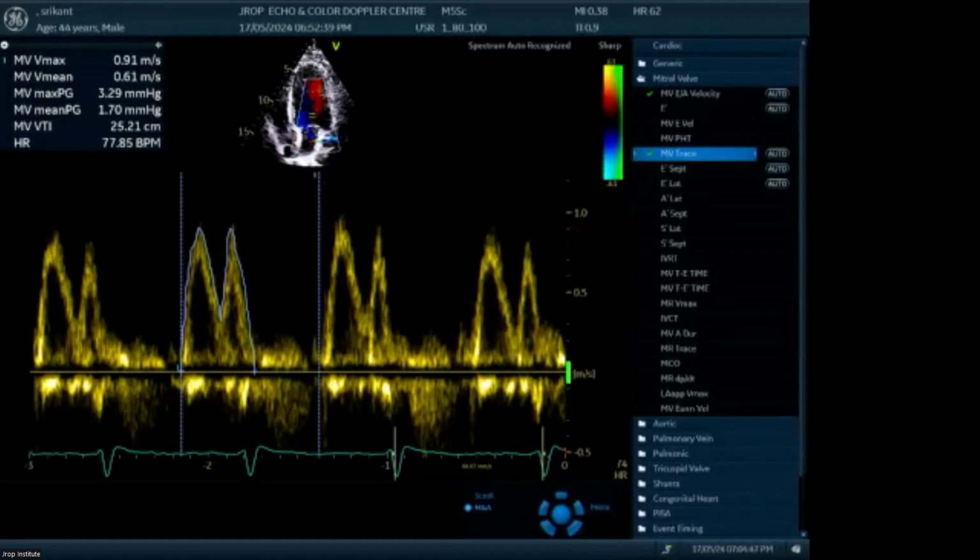Dr. Mahananda Mahatre and then Dr. Ripan. Sir, would you please explain again LVOT Doppler and aortic Doppler, where you will put the sample volume cursor? Sure, I'll do that.